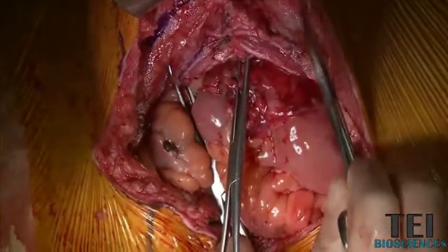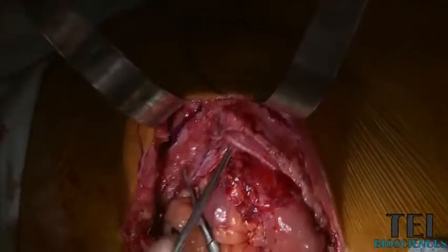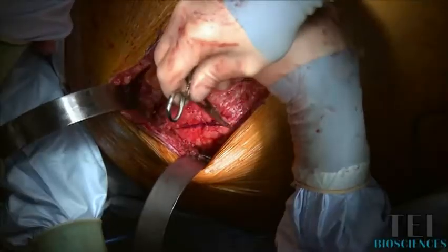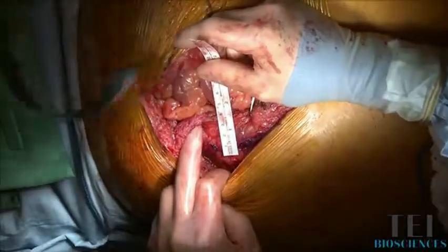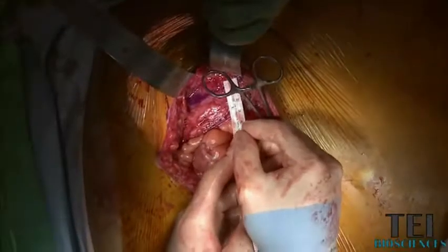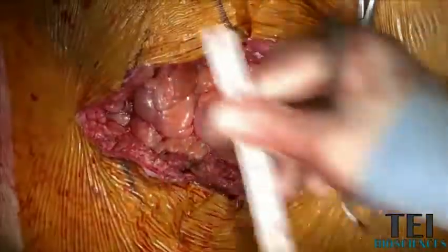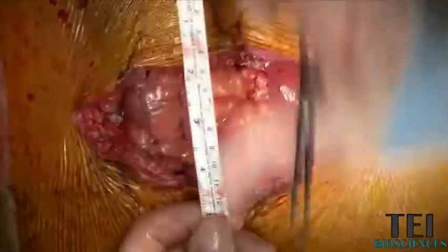I'm marking my suture line here and I'll put this about three to five centimeters back from the edge of the fascia. We're about four centimeters on this side and about three centimeters on the other side, so that's about a seven centimeter combined distance that we have of fascial edge to bring together in the midline.